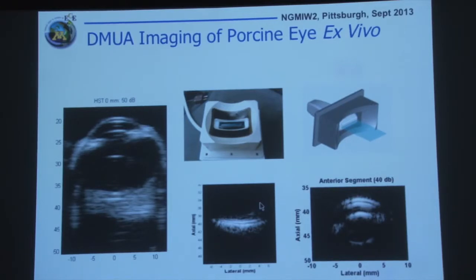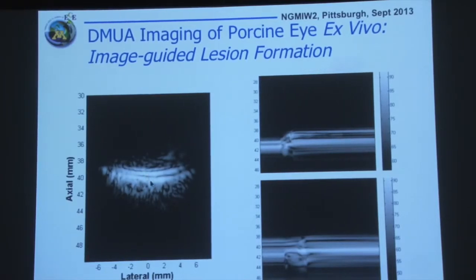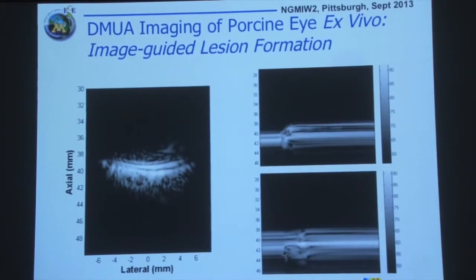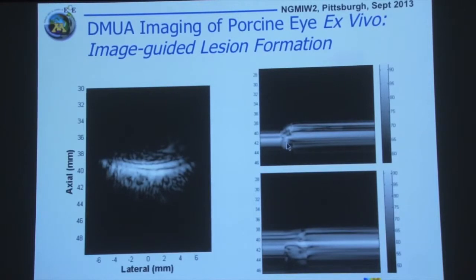But again, this is a property of the imaging system and a benefit, an advantage of the large aperture that you're imaging with. Another interesting thing that Andy has done is this, again the image on the left-hand side of the target in our case, and he put a couple of lesions, and this is M mode, so baseline, and about a second or so of heating where you disrupt the tissue, and you can see this multi-layer structure. It's preserved very nicely. So on M mode, it becomes very, very clear that we are really following that structure.